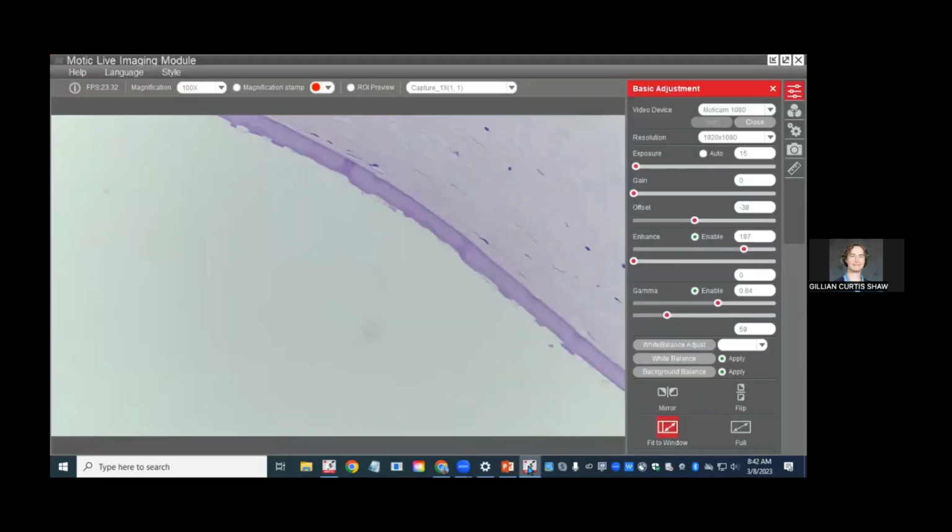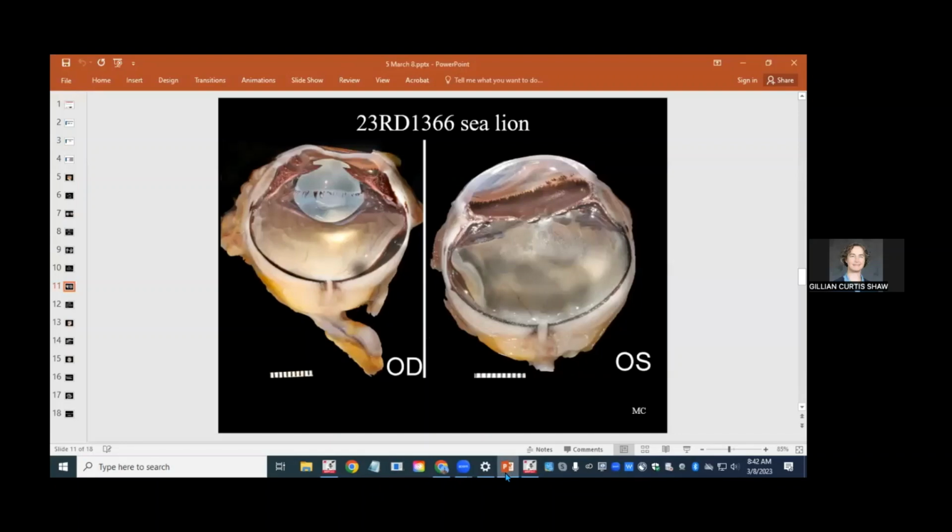We'll go to histology. Size difference, just magnification. Yeah, because you have the scale bars down here, you can see this one is a little bit wider or bigger. It's the same exact scale bar. Yeah, that is because there was a little bit extra optic nerve on this one too. So I could have cut that off and then taken the photos. At that point, it might have looked more symmetric, but that's a great question.